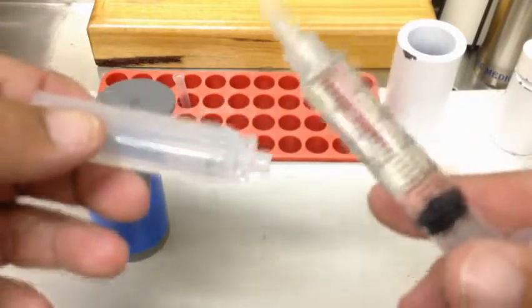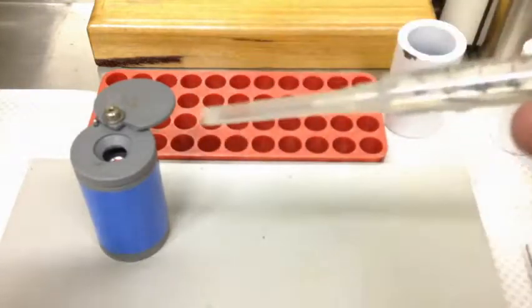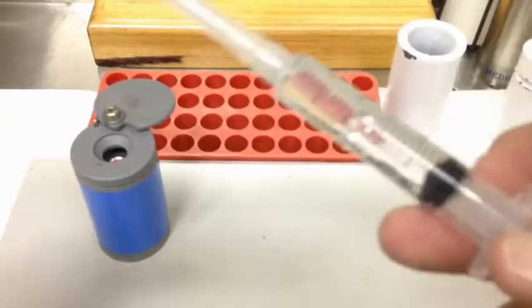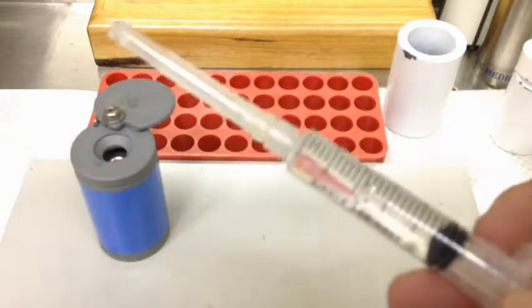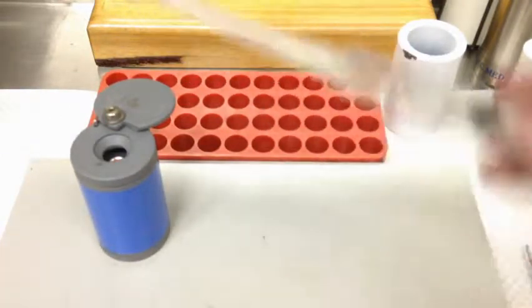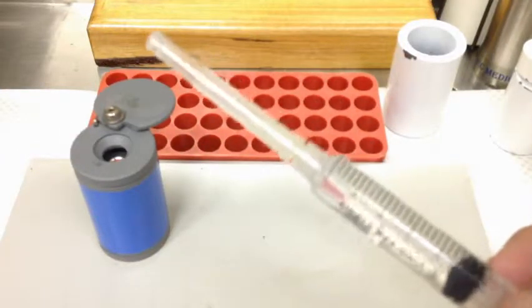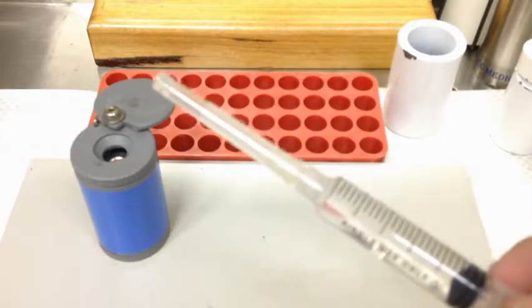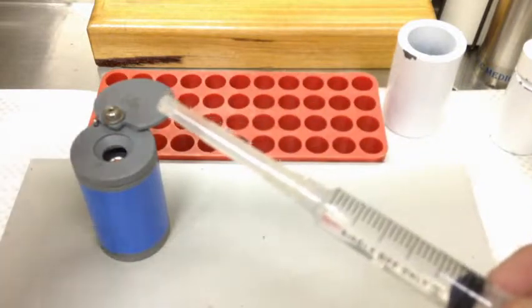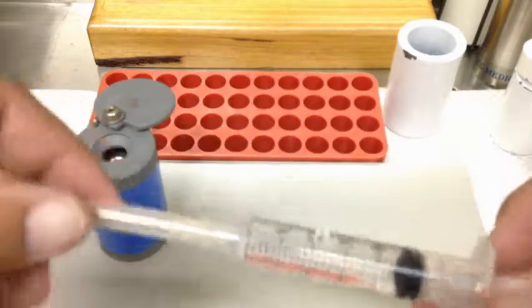So we've taken it up to 5 mils and we're pretty happy, so we're going to cap that needle. Normally that would just go straight into your vial, because we've already assayed it — we know it's our 8 gigabecquerels made up to 5 mils — so we're just going to go straight into the vial and recap afterwards. That's actually pretty simple.